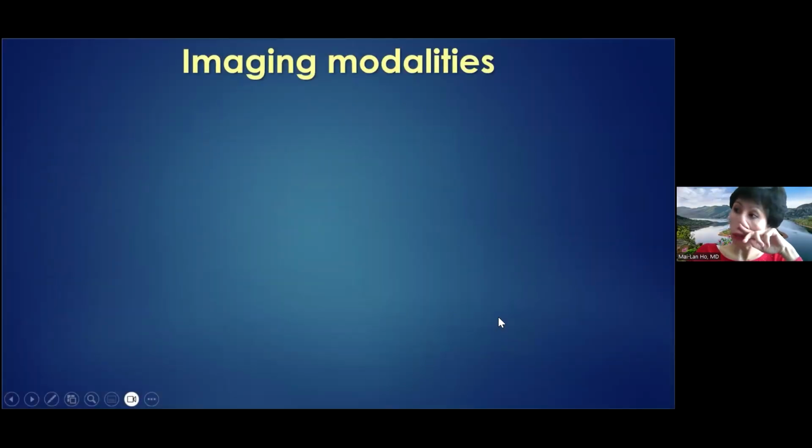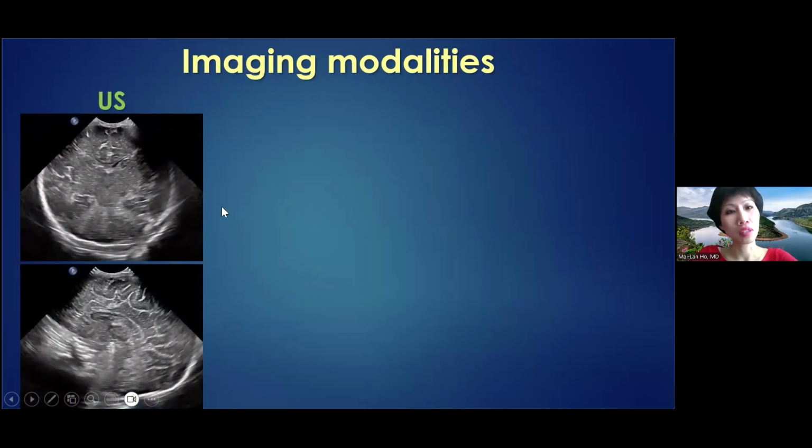Okay, so imaging modality. In the neonate, we often start with head ultrasound because there's no ionizing radiation, it's a fast bedside exam. And so they can go through various fontanelles, which are essentially these open, non-ossified fibrous things in the skull. The sutures and fontanelles are there because they can mold as the baby goes through the birth canal, right? So you have some level of plasticity. And then as the brain grows, it keeps the sutures open and they start to narrow and fuse over time depending on age. So the anterior fontanelle actually stays open till about 14, 18 months of age.